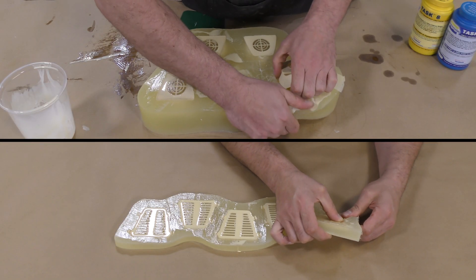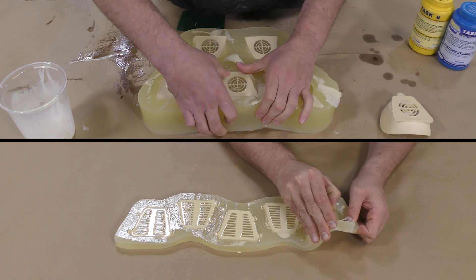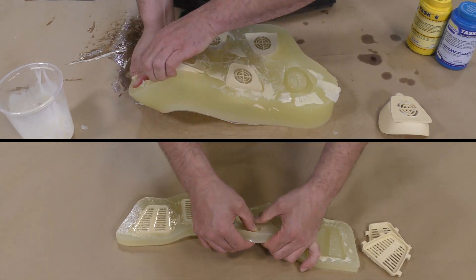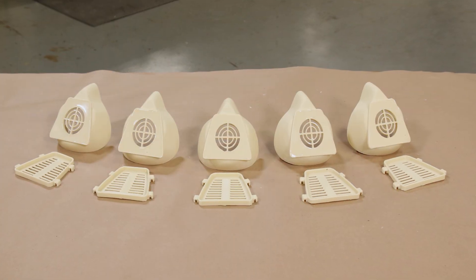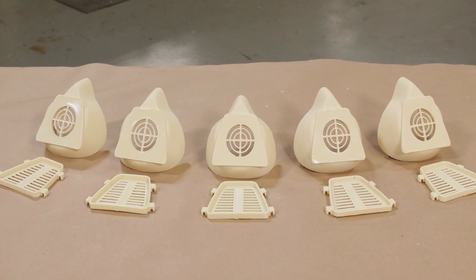We can go ahead and demold these castings. As you can see, the mold is quite nice and flexible, and I'm able to pop these out quite easily. Because we scraped the top, there isn't much flashing to be cleaned off — just very minimal. Here are our castings, ready for the next step of the process.